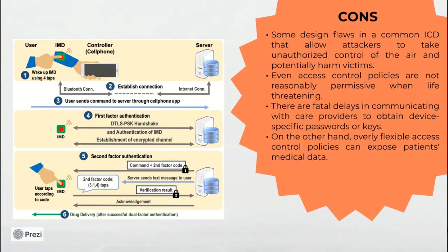Cons. Some designs found in a common ICD allow attackers to take unauthorized control of the device and potentially harm victims.